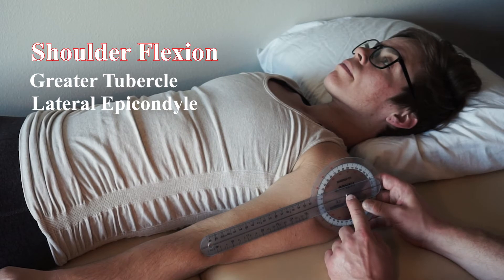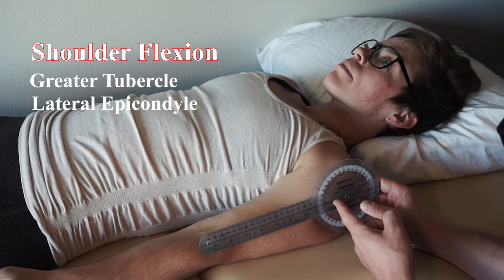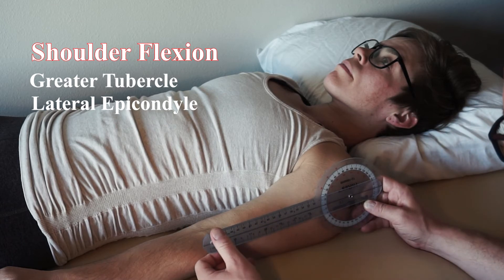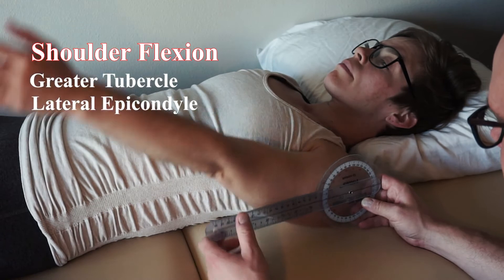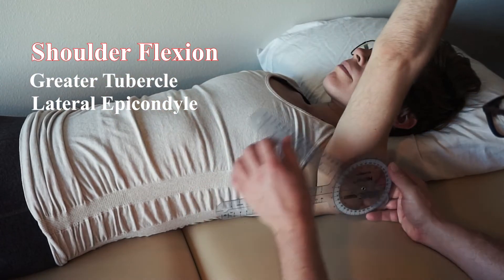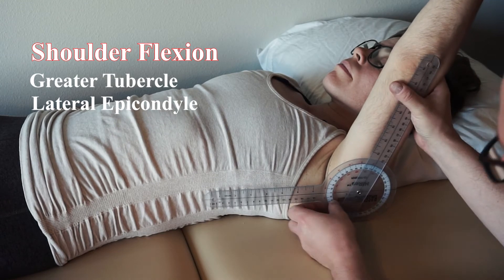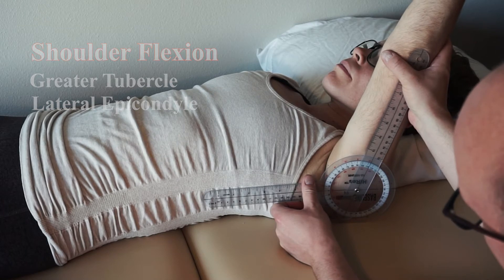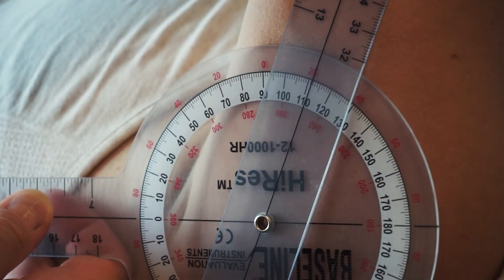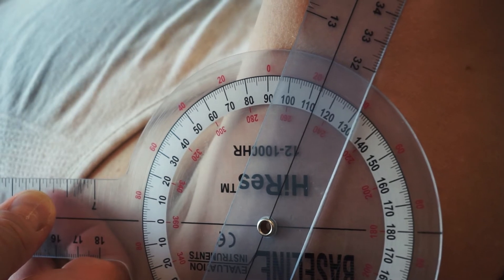Remember, once you've established the fulcrum, that's the laser going through infinitely — you don't have to follow up and over. So we have these landmarks. Go ahead and flex your arm for me. Remember the patient does it actively. Make sure we're bisecting. This starts at zero, so she's gone past 90. She's at 113 degrees of active shoulder flexion.